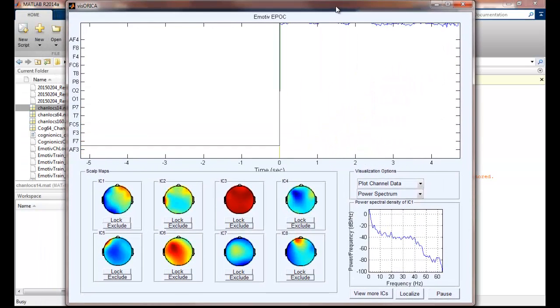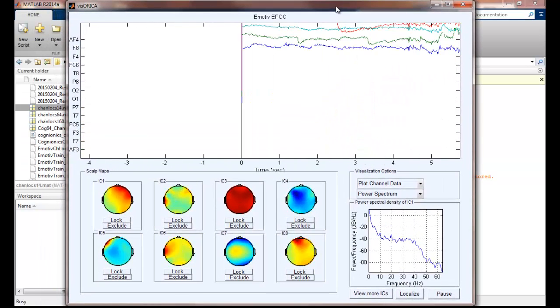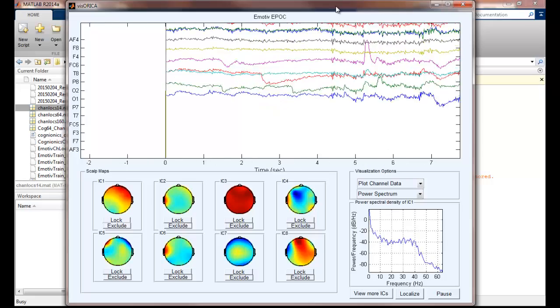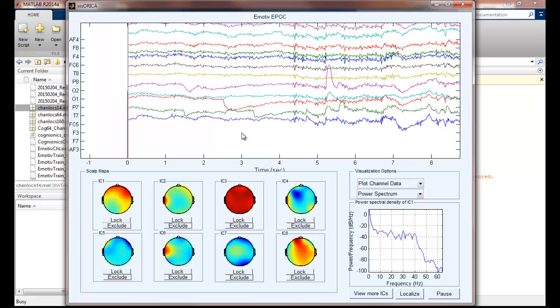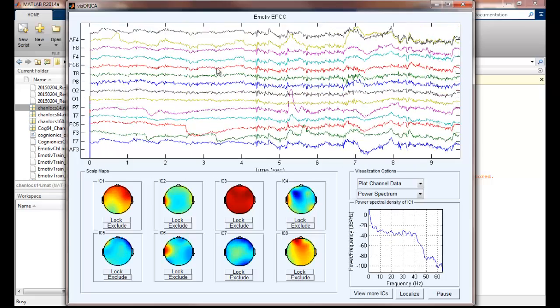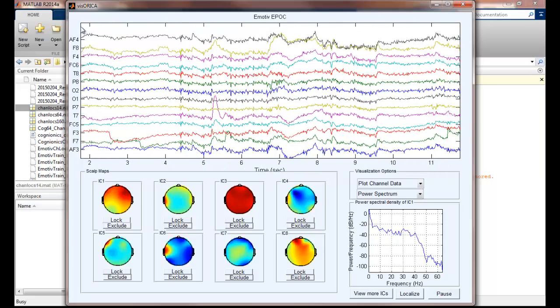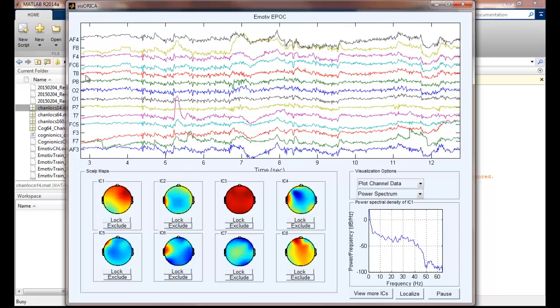So this is the EEG source mapping visualization interface. The top panel shows the time series of 14-channel live EEG data.